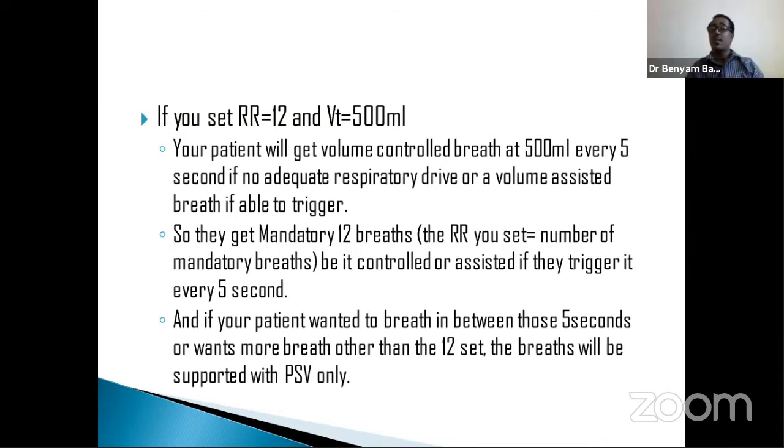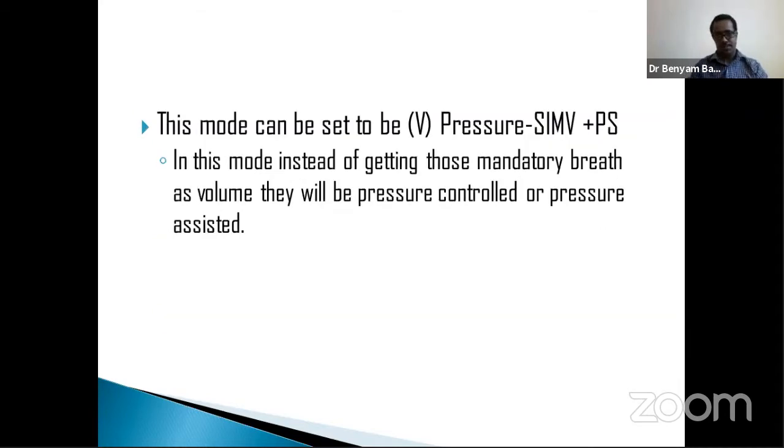So this is another mode, what we call volume SIMV plus PSV, or pressure support ventilation. I said that's the fourth mode, and the fifth mode will be vice versa. If we say pressure SIMV mode plus pressure support, then instead of getting the mandatory breaths as volume, they will be pressure. Because we already said pressure, rather than volume, they will get pressure.